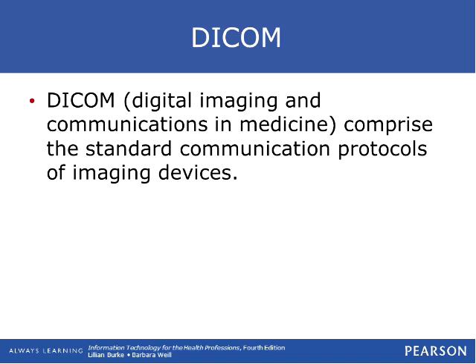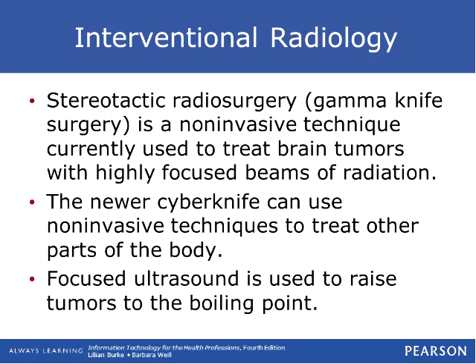DICOM is Digital Imaging and Communication in Medicine. It comprises the standard communication protocols for imaging devices, which directs how we store and transmit images, so that one system isn't different than another.